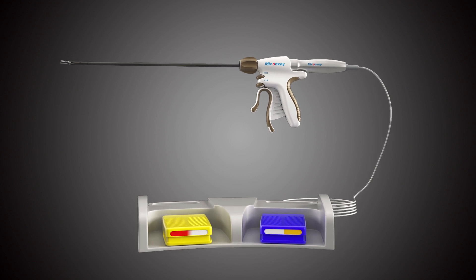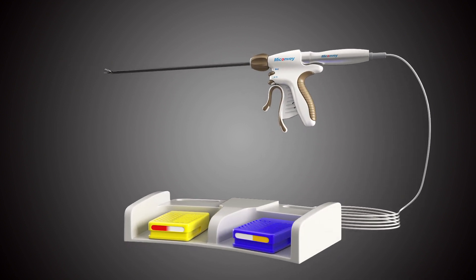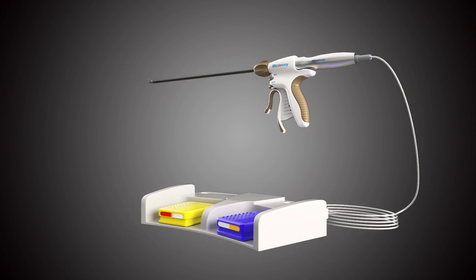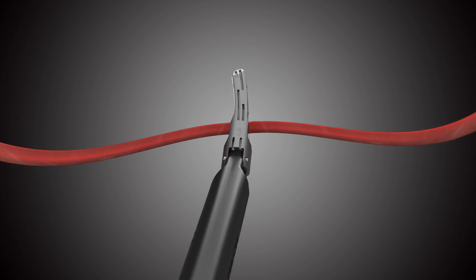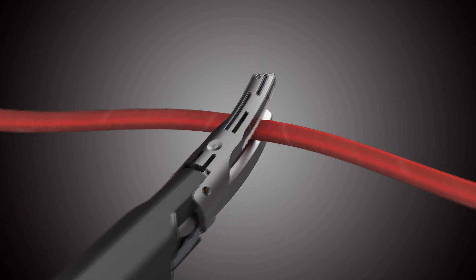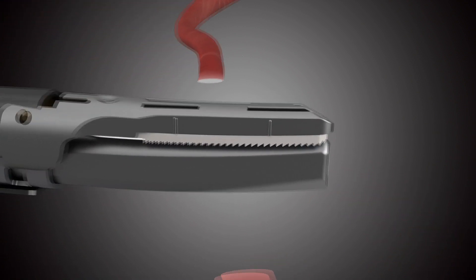Gun type integrated manual control operating system with manual control, foot control function, and one-button switching function can meet various usage habits. The curved jaw design with multi-function of cutting, haemostasis, separation, and grasping makes the operation faster and more convenient.